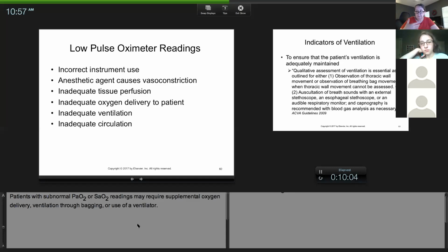So sometimes, but spay and neuters should be quick. Some of my surgeries were 4 to 6 hours long, so I'm constantly moving it because of perfusion. But if I moved it to 2 or 3 other spots and I kept getting 92, 92, 92, I'm like, okay, I've moved the probe. Sometimes I've cleaned the probe.